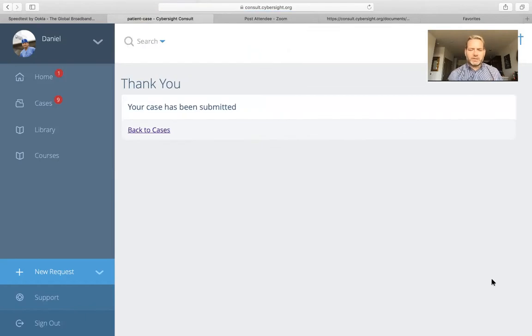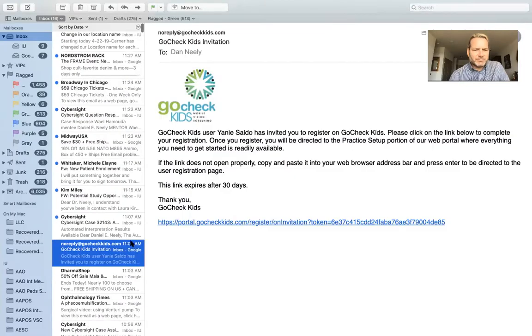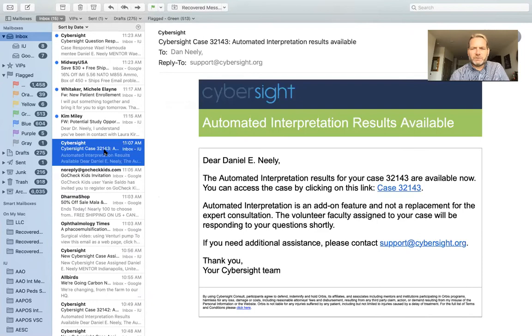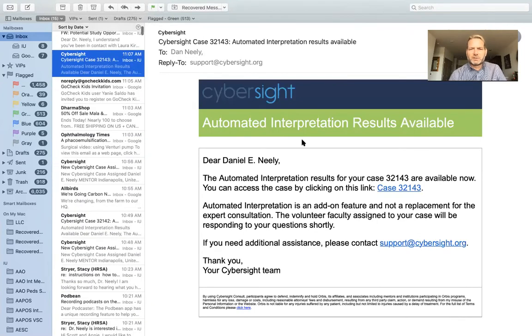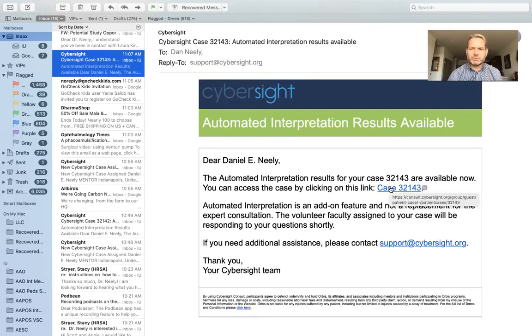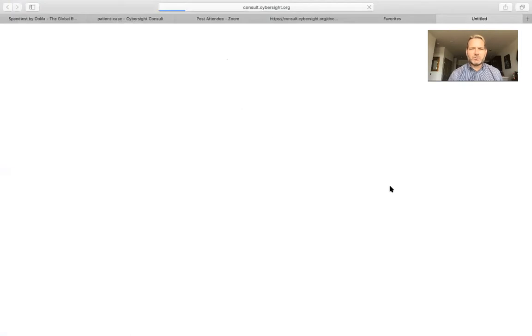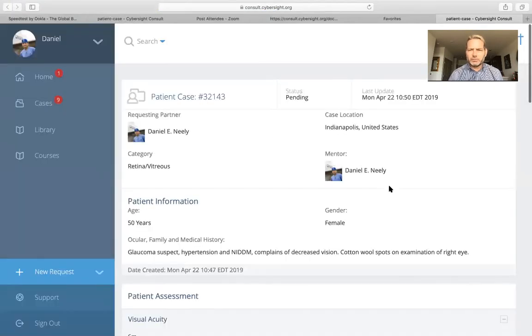Now the mentor receiving your case will be notified and will be getting back to you within 24 hours. But in the meantime, within just a few minutes, you've received a notification that the automated interpretation results are available. You simply follow the email link you received and can get the report almost immediately.